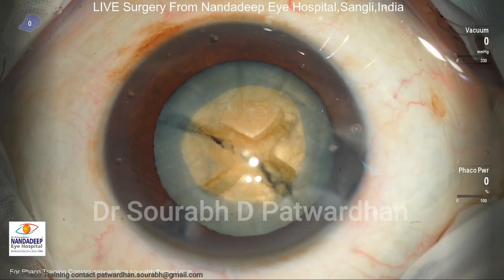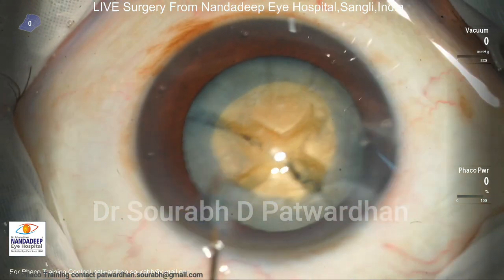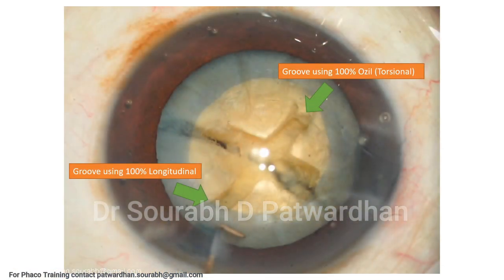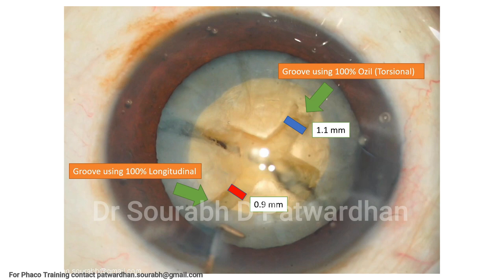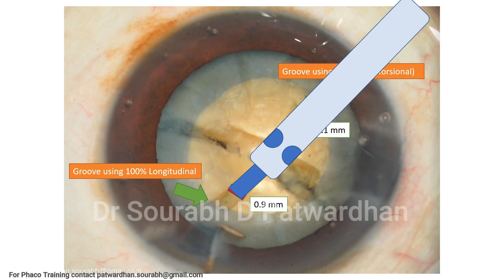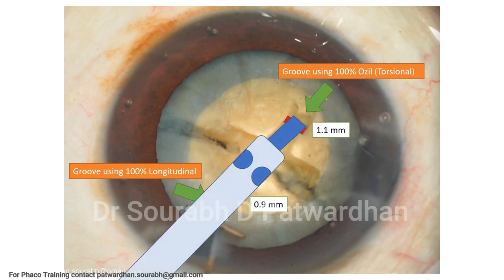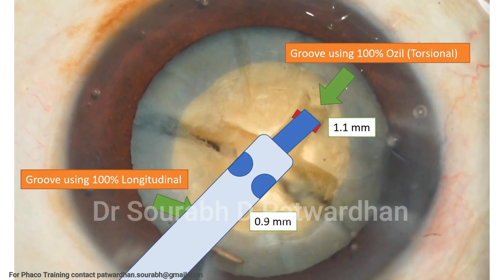After completing the trenches on both sides, I measured the groove on both sides using a 1.25 millimeter Sinski hook to compare sizes. When I compared the groove made using 100% longitudinal FACO power, it was just 0.9 millimeter — similar to the size of the FACO tip. With 100% torsional (OZL), it was wider, around 1.1 millimeter, using the same 0.9 millimeter FACO tip. When doing the chop in the groove made by longitudinal, the tip fits very snugly, and that's why the hold over the nucleus is better.